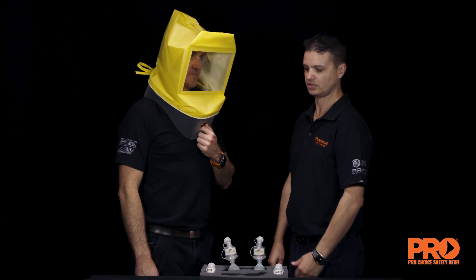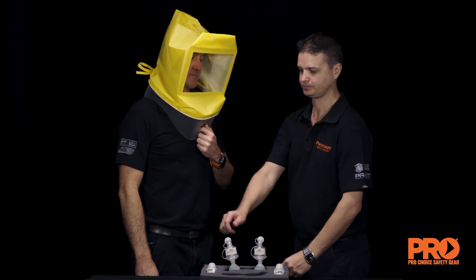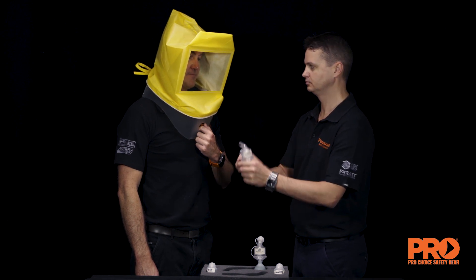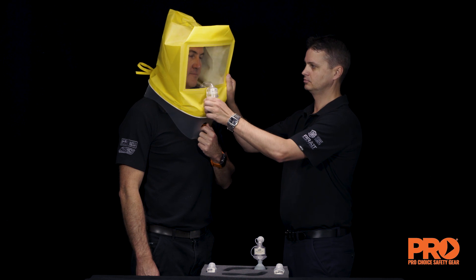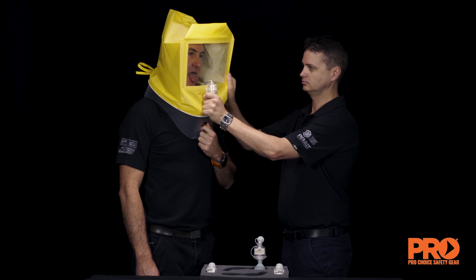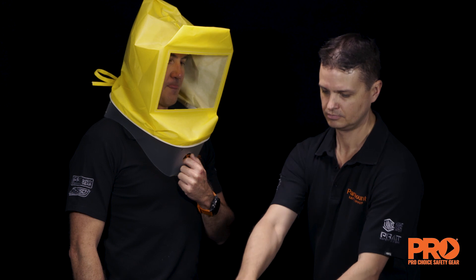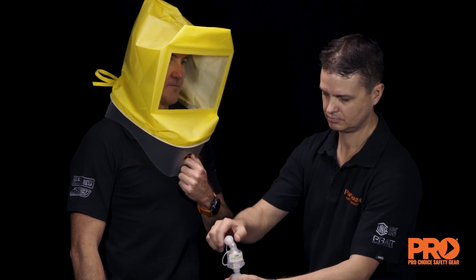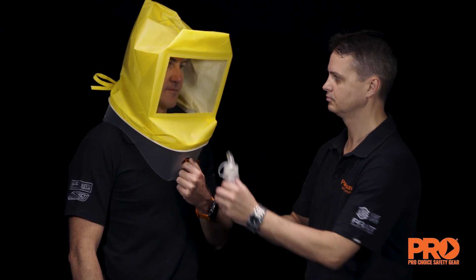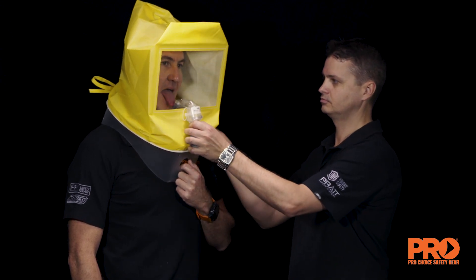Have the test subject put on the hood and collar assembly without a respirator. Position the hood assembly forward so that there is as much room as possible between the subject's face and the hood window. Instruct the test subject to breathe through their mouth with tongue extended. Using nebuliser number one with sensitivity solution, inject the aerosol into the hood through the hole in the hood window — slowly inject 10 squeezes of the bulb, fully collapsing and allowing the bulb to expand fully on each squeeze.